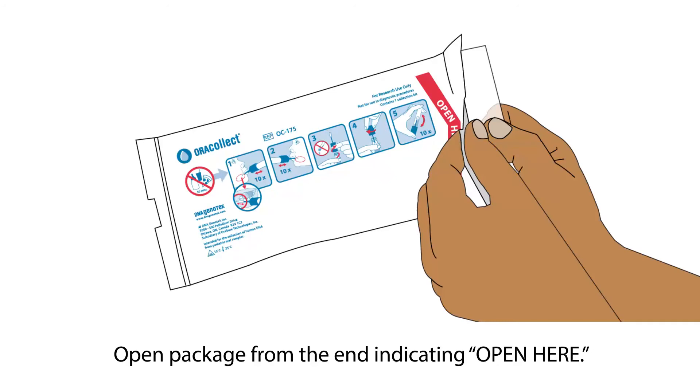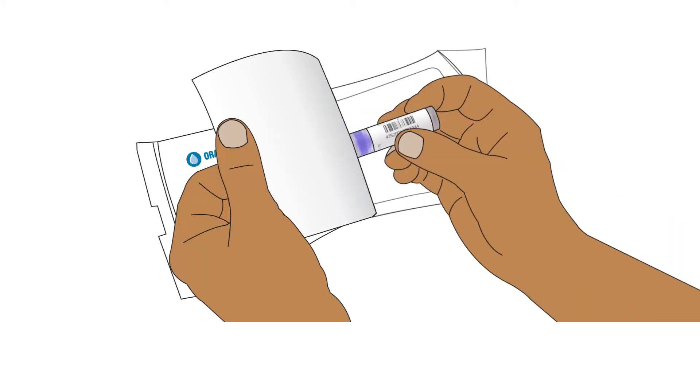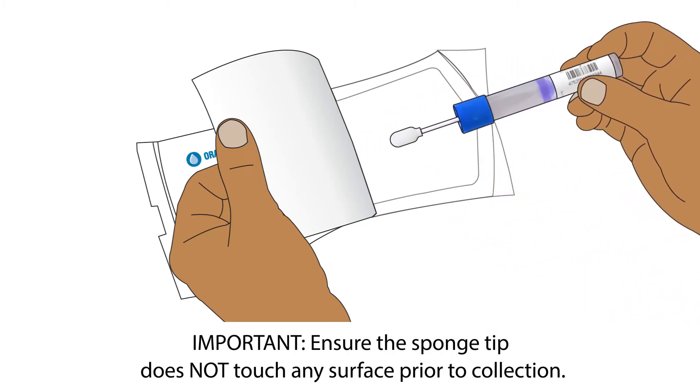Open the package from the end with the Open Here arrow. Remove the Collector by its handle from the packaging. Ensure the sponge tip does not come into contact with any surface prior to collection.